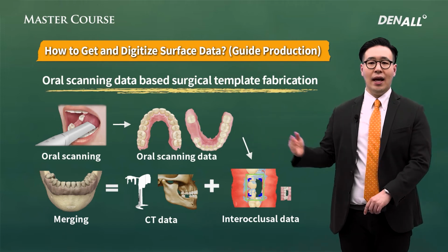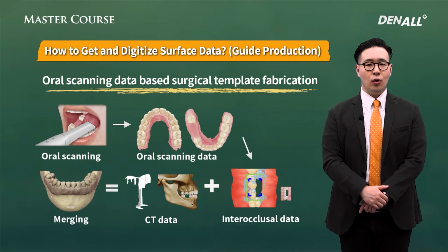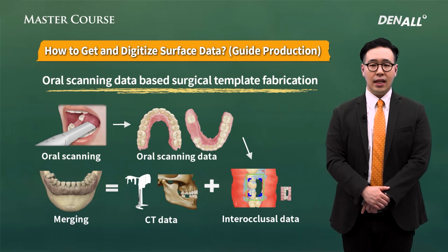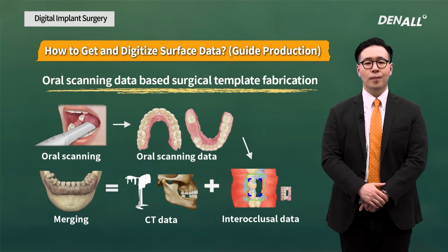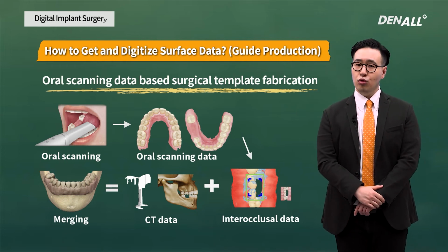If the patient's occlusion is stable, using an intraoral scanner, you can get the most accurate data. Whether it goes to the design center in your clinic or to the OSSTEM One Guide Center, the data can be immediately sent so that an accurate guide can be fabricated fast.